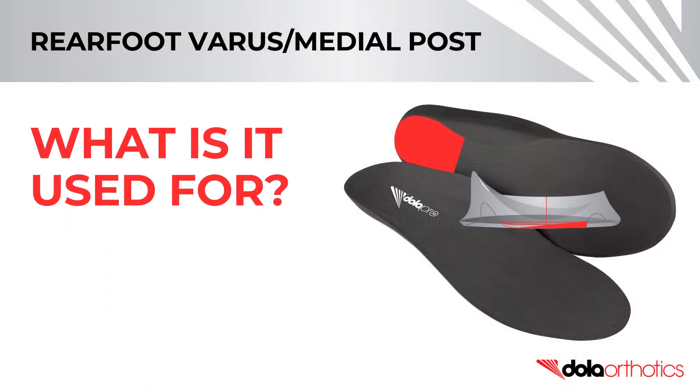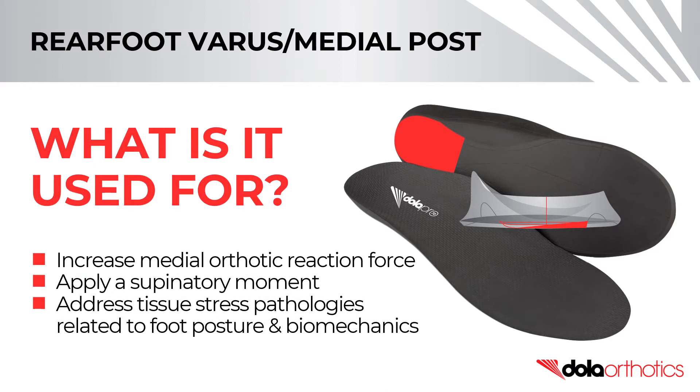A rear foot varus intrinsic grind is used to increase medial orthotic reaction force, apply a supinatory moment, and address tissue stress pathologies related to foot posture and biomechanics.